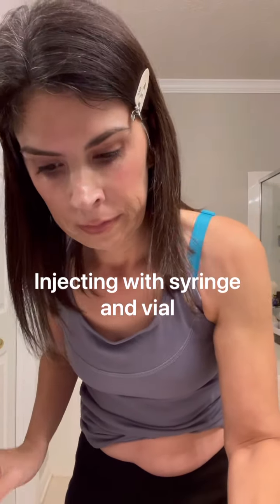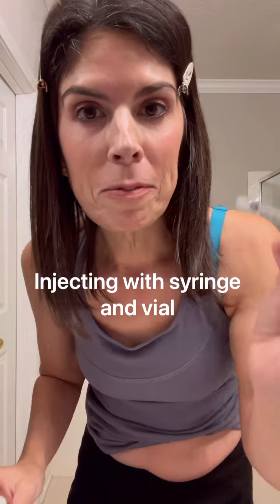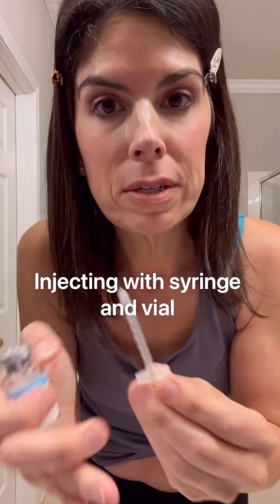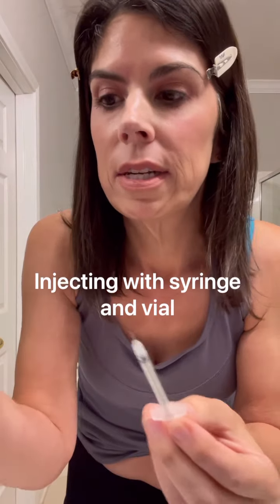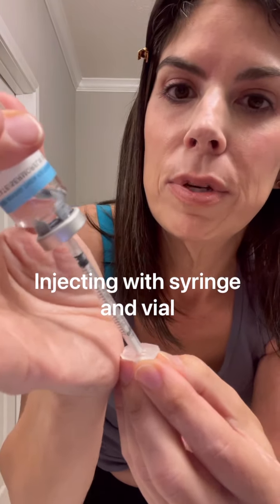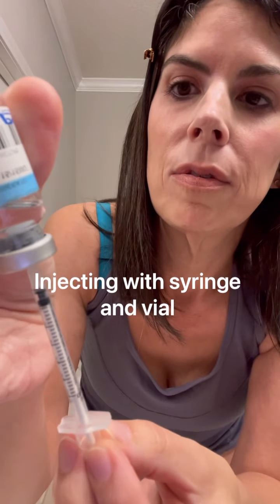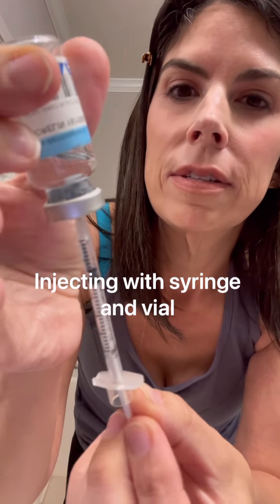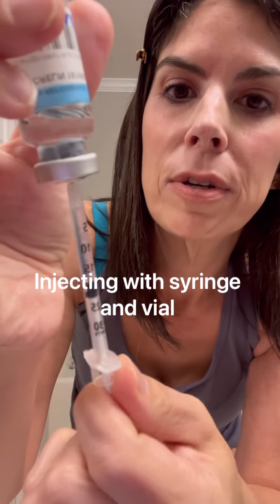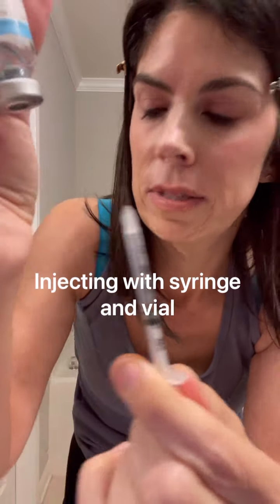Let me demonstrate one more time. Remember to prime your new syringe first so it draws the medicine up more easily. Then gently draw the medicine up to whatever number you're supposed to — in this case, to the 0.2 line.